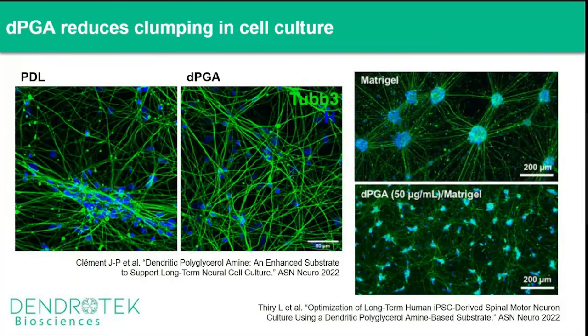So how does dPGA perform? On the left panel here, we're looking at iPSC-derived neurons that were plated on PDL or dPGA. The green staining is for beta tubulin, and the blue staining is a nuclear counterstain. And you can see the clump on the left and basically the absence of clump on the right. Now, this is sort of more of a zoomed in picture, but we'll see this time and time again where users observe the reduction in clumping and better adherence in the dPGA condition.